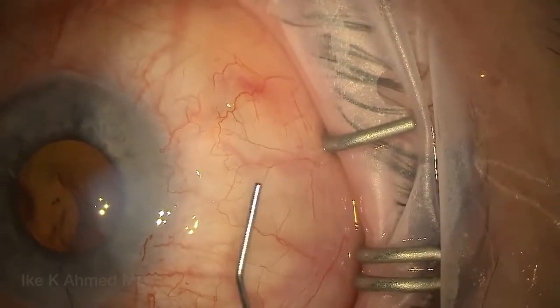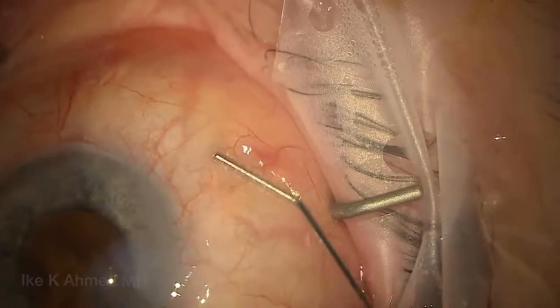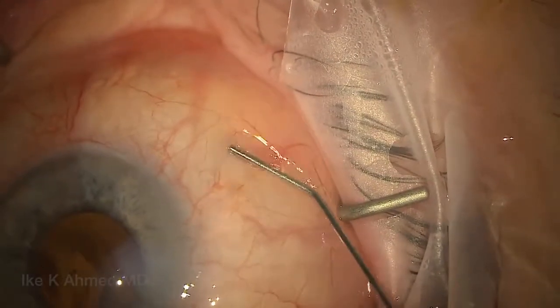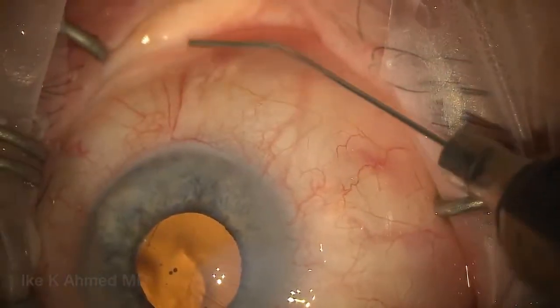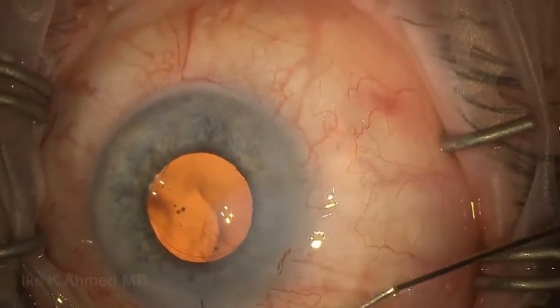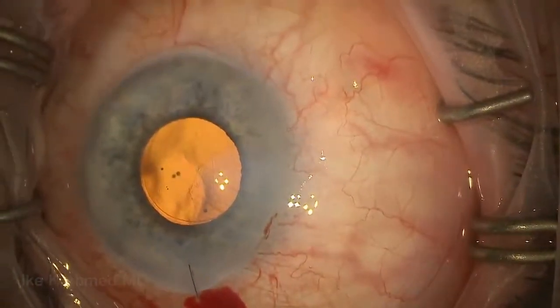You can look at the conjunctiva and see how translucent it is — you can see the conjunctiva clearly, and underneath you see tenons and sclera, telling us that we've separated conjunctiva from tenons by this very thin elevated bleb with fluid underneath it. The intraocular pressure is quite good, typically because of the controlled flow, and we have a well-formed wide bleb at the end of the case, which is ideal in these scenarios.